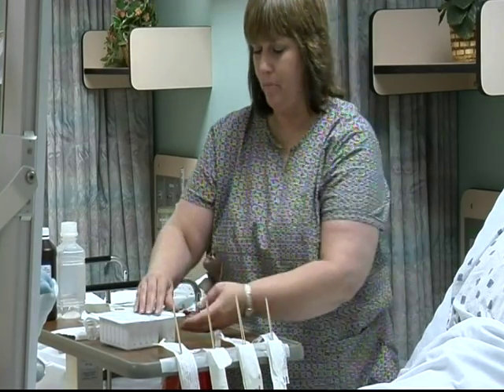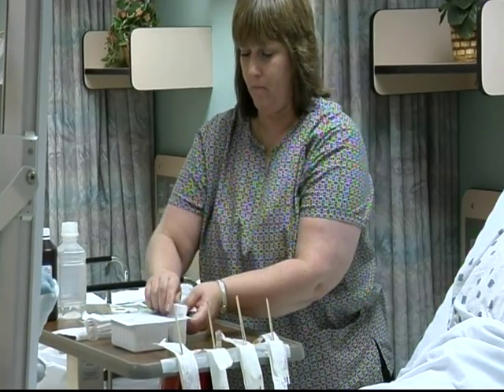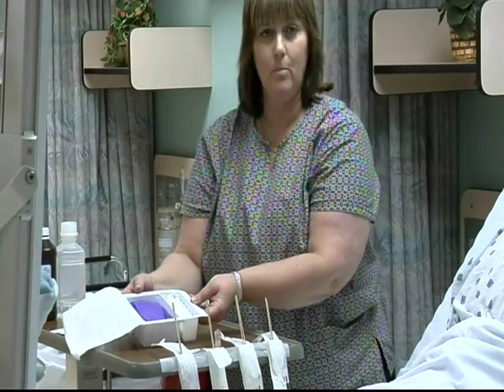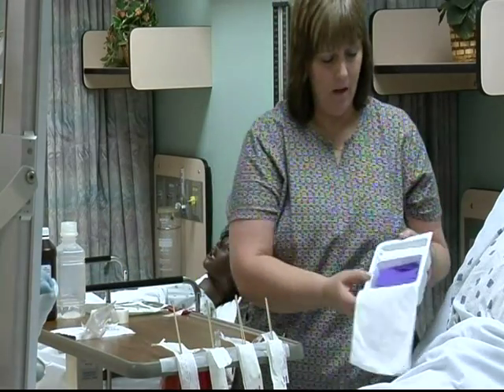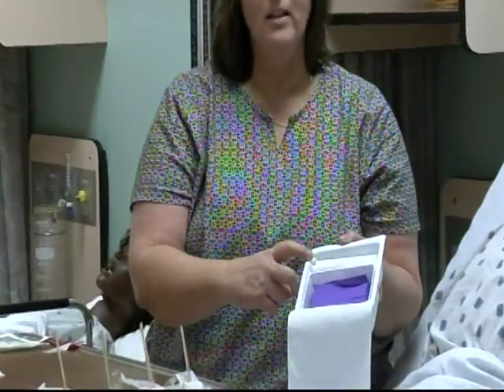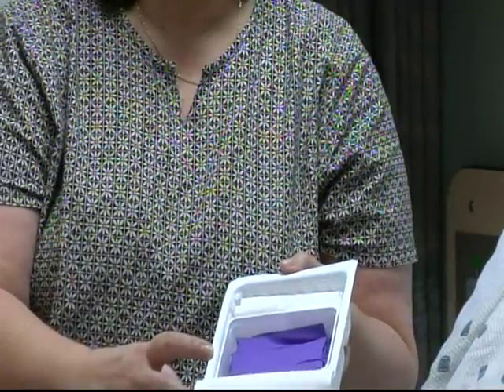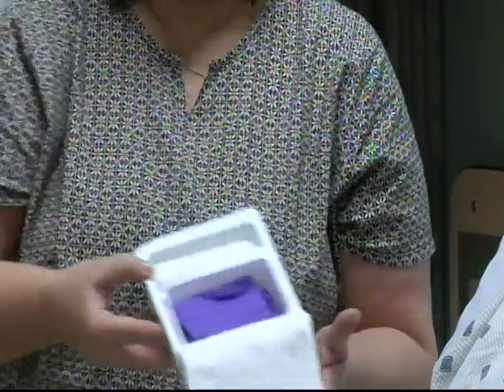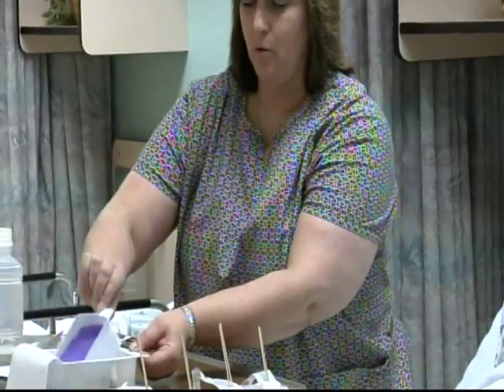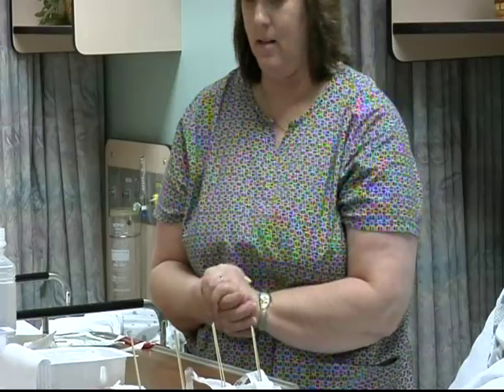Your Q-tips are open. Then you'll need to open your trach kit. Now, I'm going to pick this up so I can show you on the inside. There are two slots. The front slot is going to be for your peroxide, and the back slot is going to be for your normal saline. Now, what I want you to do is just touch the lip of the inner tray and slide it off to the side, because you will not be using any of that.